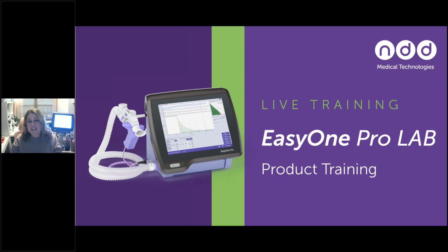If they can manage to stay above 90%, I would say take them off, wait 10 minutes and do the test so that you can start at a true baseline. If they cannot come off of their oxygen, just make sure that you're leaving a note for your physician. Individual labs need to establish with their providers what that policy and procedure is going to be for those patients.